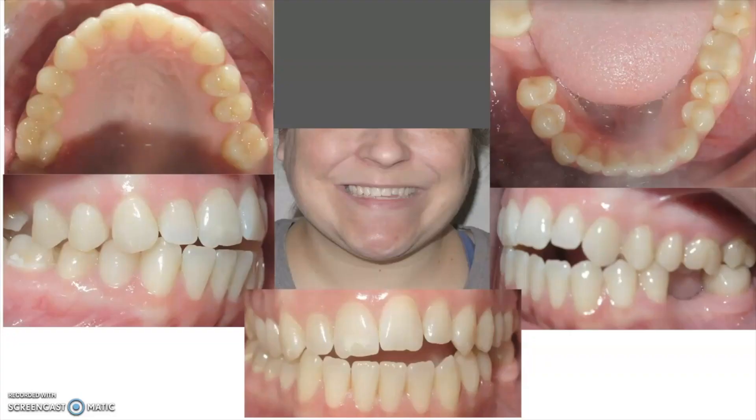Over time, the tongue is a very strong muscle and it can actually move the teeth. Once the teeth start to open up, this tends to exacerbate — the tongue will go into that spot every time they swallow as the mouth tries to form a seal. In order to form a seal, the tongue has to fill in that space. So once the open bite is there, it's hard for it to close down on its own without moving those teeth manually. This patient has generally straight teeth with a little crowding top and bottom, but her major concern was definitely her open bite.